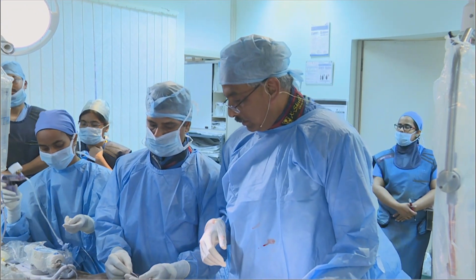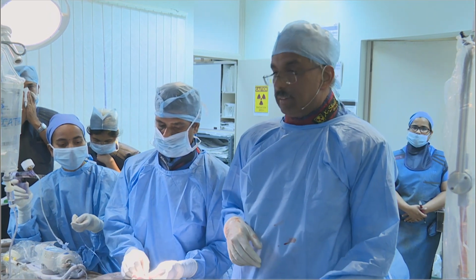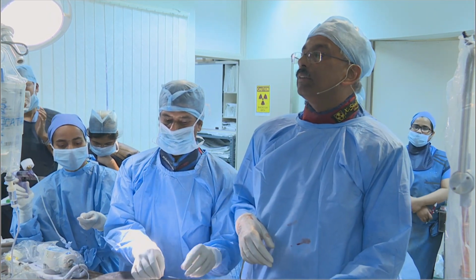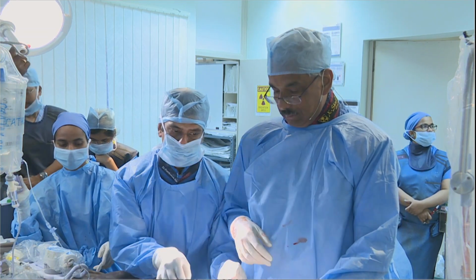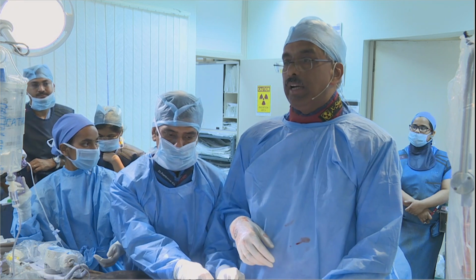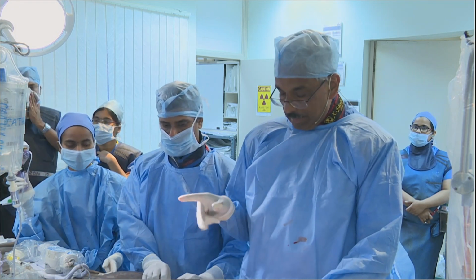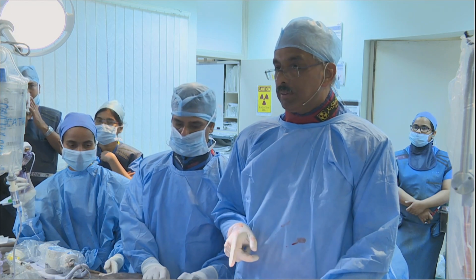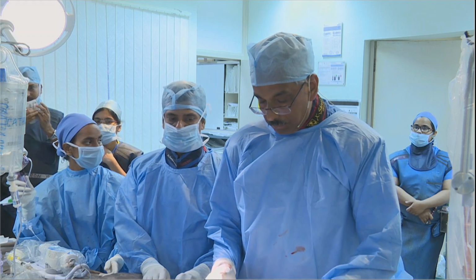But Dr. Ajit, I have a different doubt. Actually, with this calcium in the mid RCA, what is the chance that you can take a stent down without doing anything in the mid RCA? I don't know, just by seeing this. I'm not sure yet, but what I'm doing is I've got a buddy wire, and now I'm going to get an angiosculpt and get that there. If it goes through, then I'm lucky.